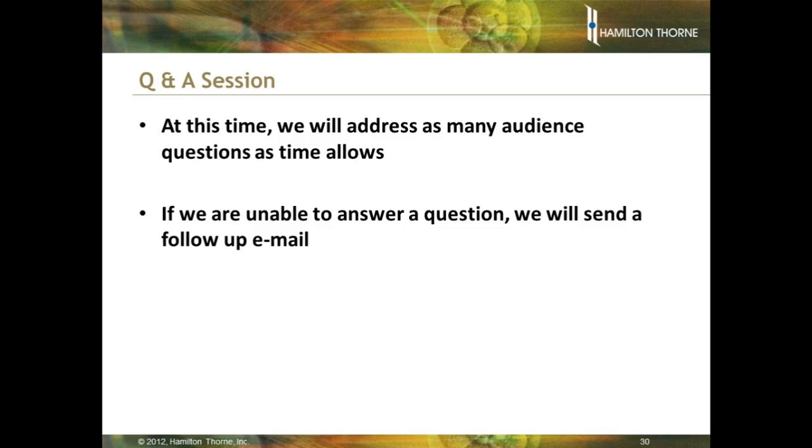Another question: is there an ideal droplet size in which the embryo can be placed during assisted hatching biopsy procedures to minimize the high temperature related risks? I can answer this, but I think Dermot can as well. Sure. I think the heat and cooling is so rapid that the drop size is like the ocean relative to the size of an embryo, as small as you can make it. So we typically hatch or biopsy in 20 to 25 microliter drops.